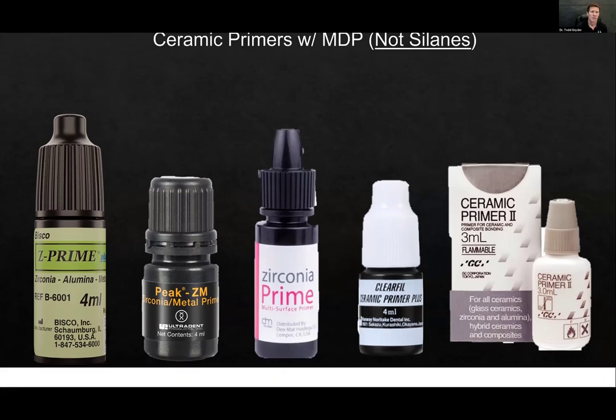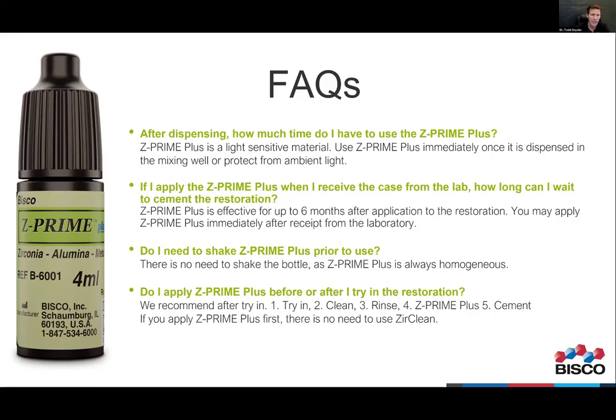All right. So a couple other facts here. After dispensing the Z-Prime Plus, you may say, how much time do I have with this? Well, it is light sensitive, so obviously once you dispense it, you want to use it. You may ask, how early can I put this on? Well, you can put it on up to 6 months ahead of time, so you get plenty of working time there also. Someone else may say, do I have to shake this stuff? You don't have to shake it. So again, when you go back to the handout and ask what was said for this, that's why I throw these in here. They're very simple, straight from the manufacturer.